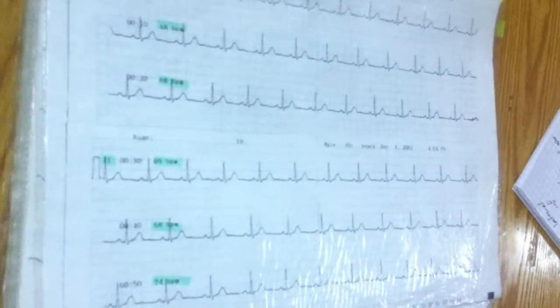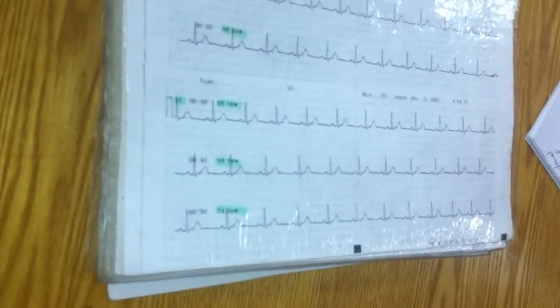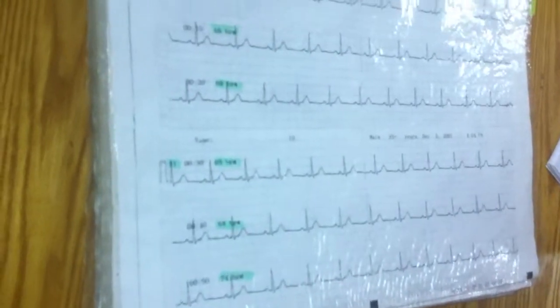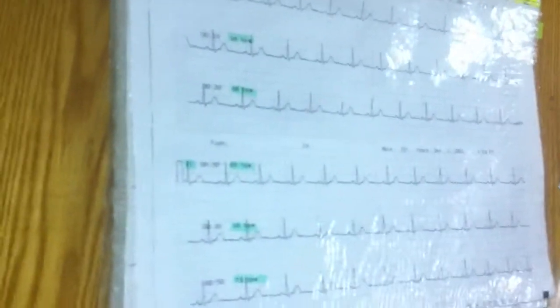If you see, for example, as in this ECG, only the rhythm strip, then as a response, you say whether there are any rhythm disturbances or any conduction disturbances. It's not a clinical diagnosis, it's your conclusion. So you should understand that you should not diagnose from the ECG. You should give your conclusion. You should describe and give your conclusion as per this algorithm.